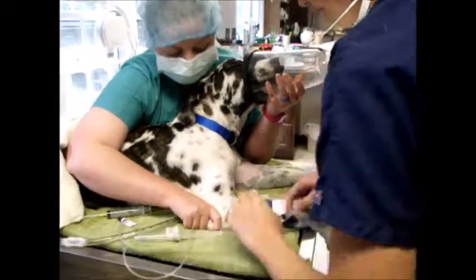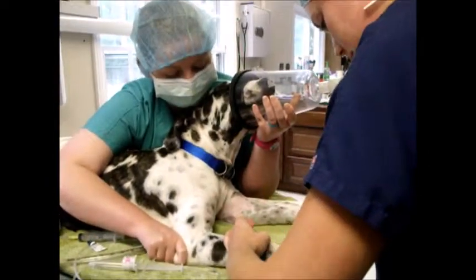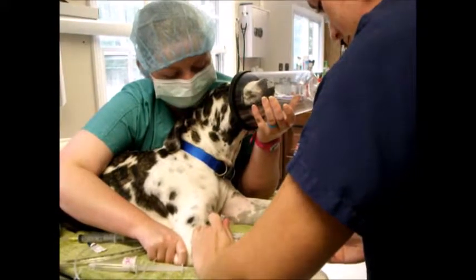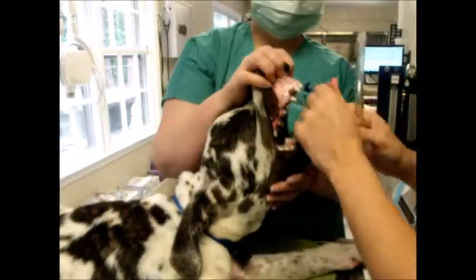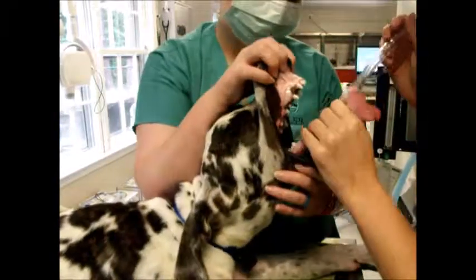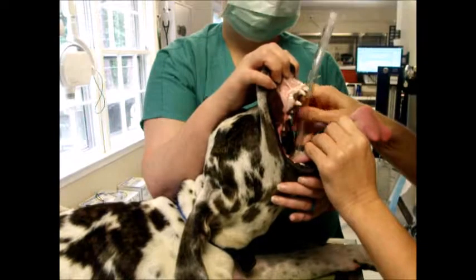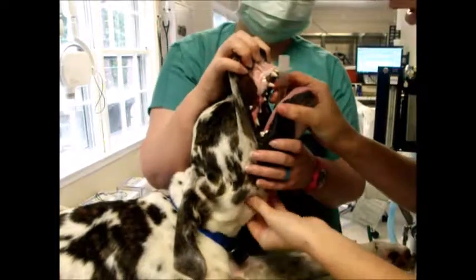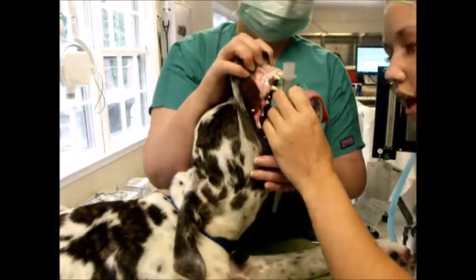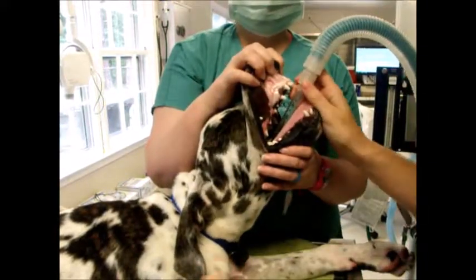Now I'll flush her catheter again. I'm going to have my tech hold her mouth open and I'm going to pull her tongue out. I'm going to push the soft palate up, pull the epiglottis, view the laryngeal opening, and insert the tube. Now I just want to double-check that she's in — she's breathing, and the tube is fogging up. I'm going to put her oxygen back on. She's got one tube, so I'll go ahead and tie her in.